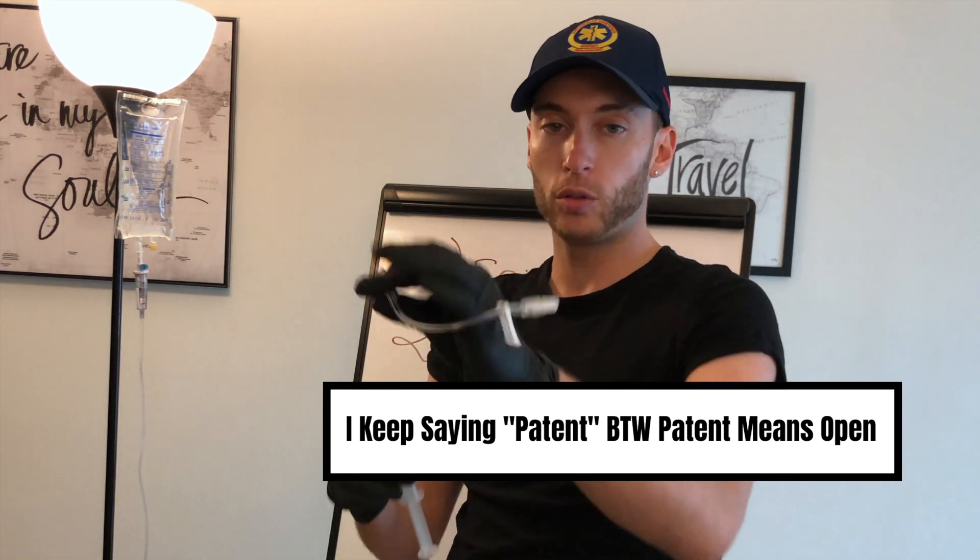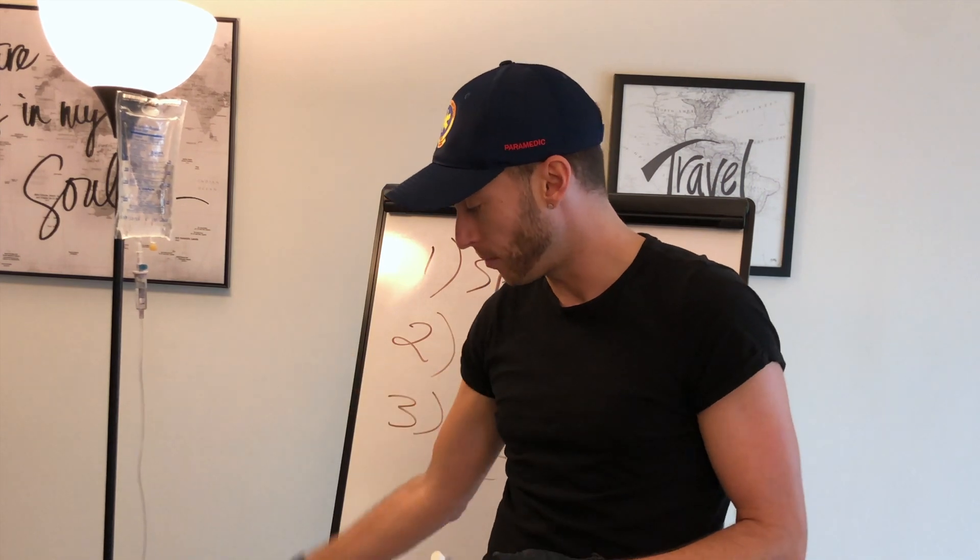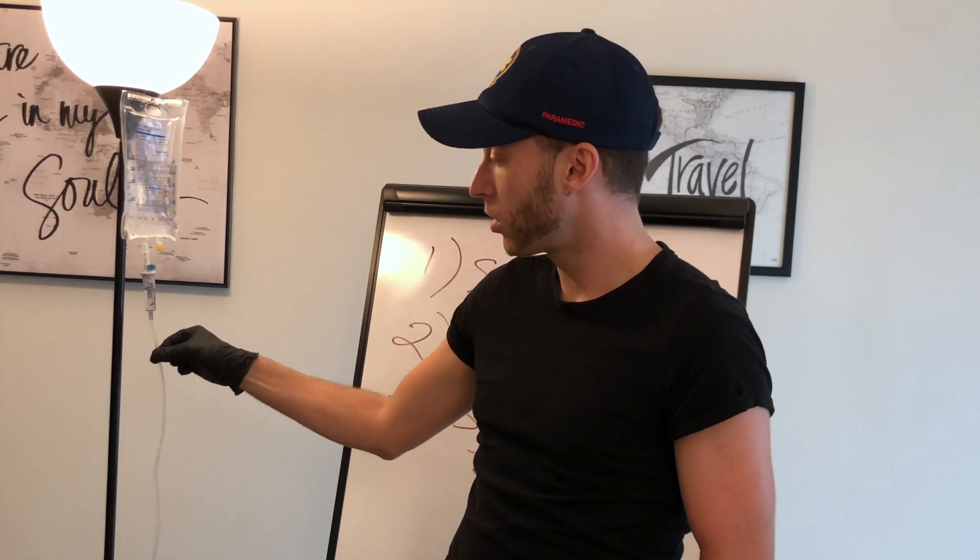What I'm going to do to set up a lock is I cannot have it with air. Just like when I flush the line, I need to flush the bubbles out. If you put an IV in a patient and you don't flush your lock and you don't flush your fluid line, you're going to put air into the patient. Air does not belong in our bloodstream.